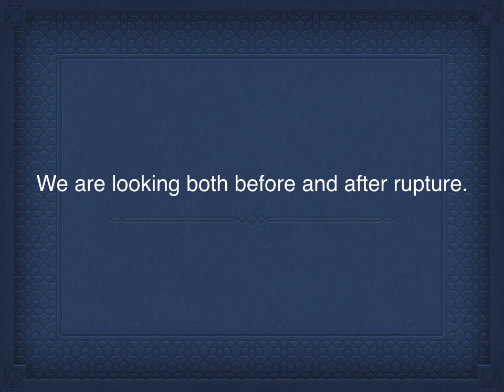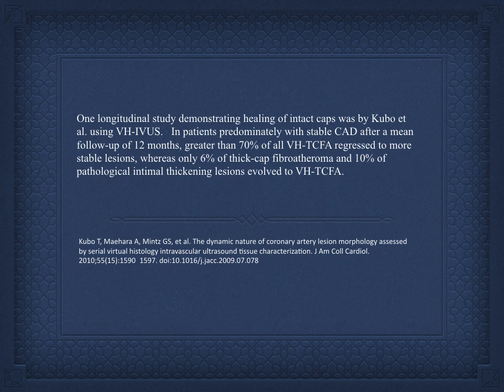So if you have a long core, your healing mechanisms are likely to be reduced. And so this study by Kubo in 2010, it is a virtual histology IVUS study, so that does have its limitations in identifying TCFAs, but they found the majority of TCFAs became stable plaque. But if you don't have intact healing mechanisms, and again we'll go into why long cores in particular would have poor healing mechanisms, at least in part, then that area is not going to heal.